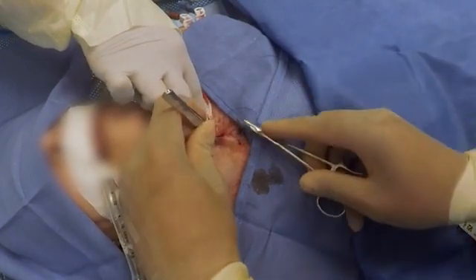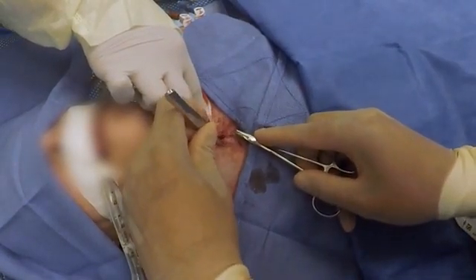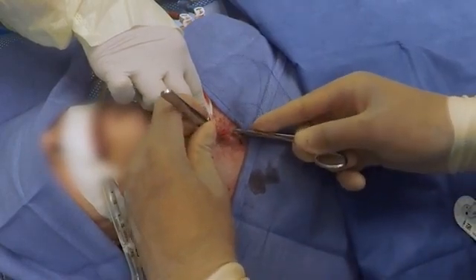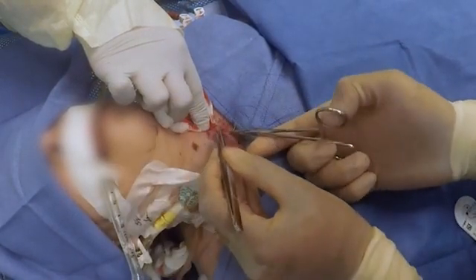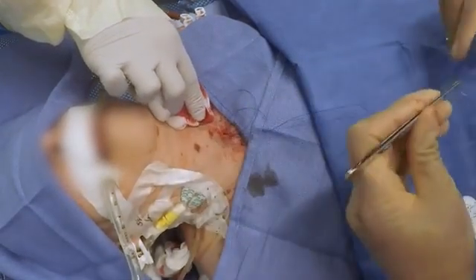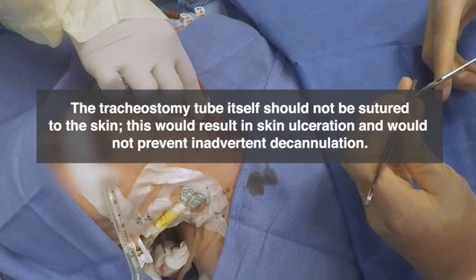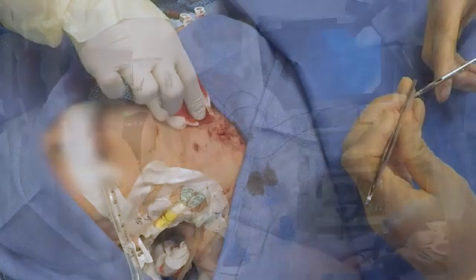The purse-string suture is placed but not tied during this step. It will be tied for additional hemostatic control once the tracheostomy tube has been inserted. The suture is generally removed on the second postoperative day if there is no evidence of bleeding. The tracheostomy tube itself should not be sutured in, as suturing a tracheostomy tube results in skin ulceration and does not prevent inadvertent decannulation.